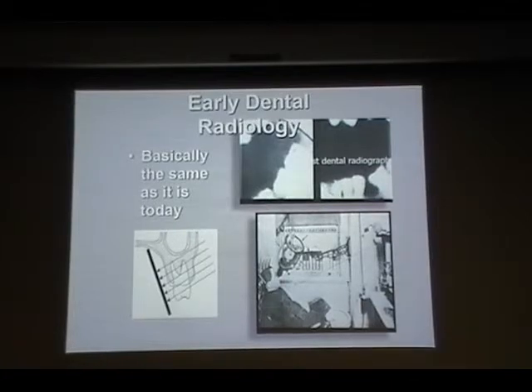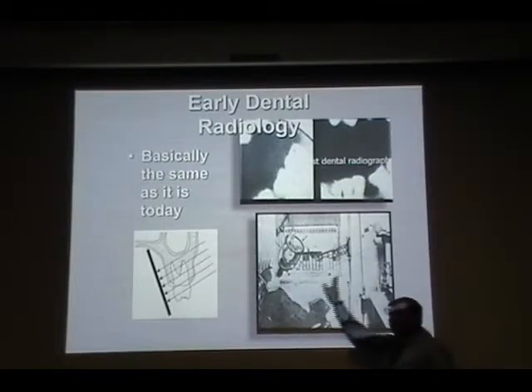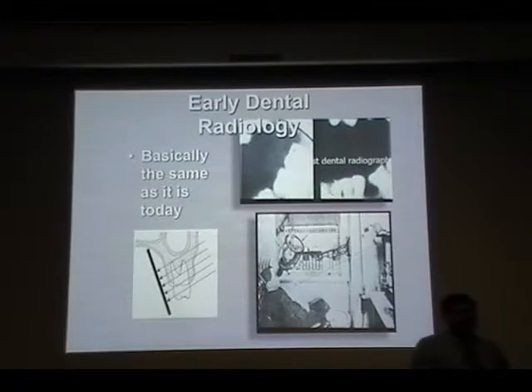And this is how the dental X-ray units looked at the time. As you can see, the wires here are pretty open. So when people were handling them, some of them touched those wires and died. Now we have fancy coverings, everything, right?